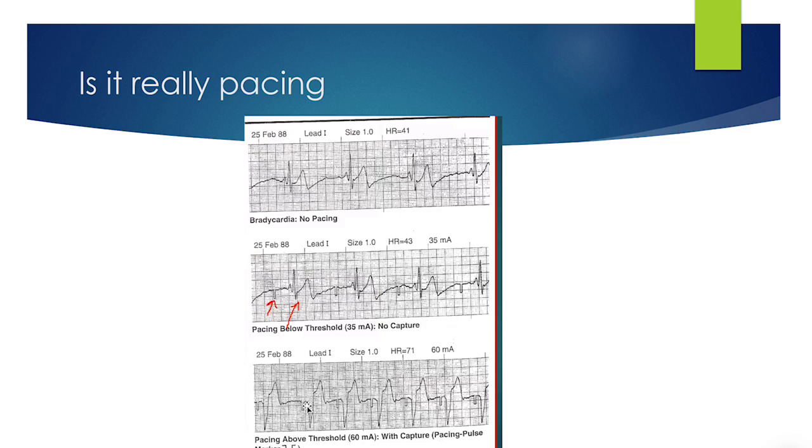You won't need to change the settings when you resume pacing.